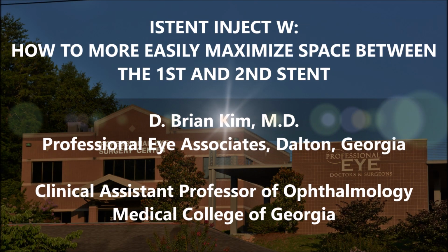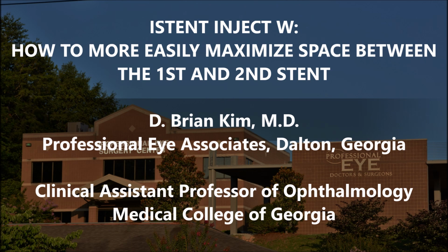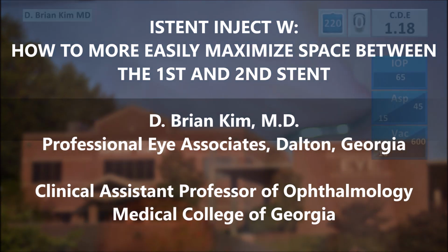I'm going to share with you another case of an iStent Inject W. And in this case, I'm going to show you how to more easily maximize the space between the first and second iStent. We all know that you have to hit different collector channels to get maximum IOP reduction. And so it makes sense to be able to maximize the space between the two stents. If you don't maximize the space, then you won't achieve the maximal IOP reduction.